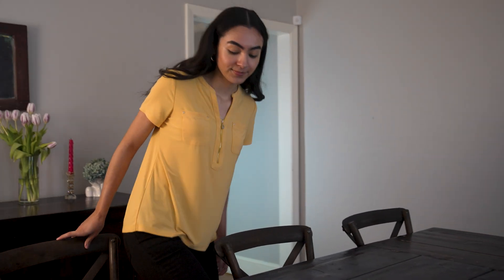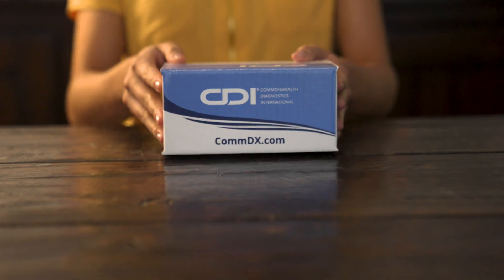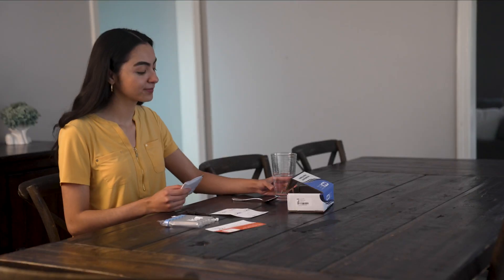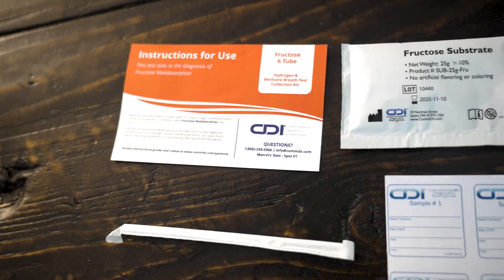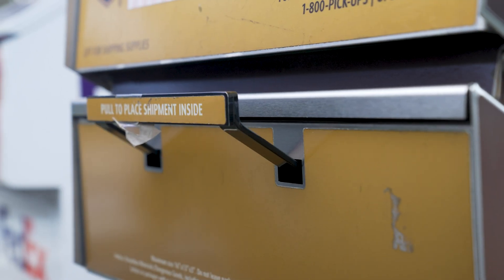Welcome to your instructional guide on properly taking CDI's Fructose 6 Tube Hydrogen and Methane Breath Test. Watch this video thoroughly and review your instructions for use provided in your kit to ensure you're fully prepared to complete your test safely, quickly, and accurately.